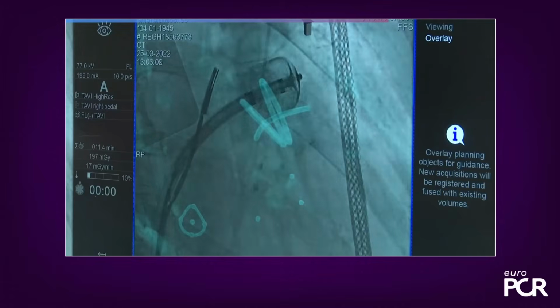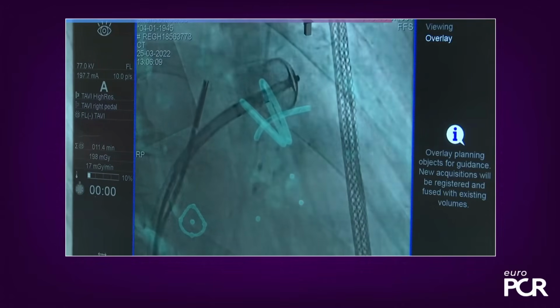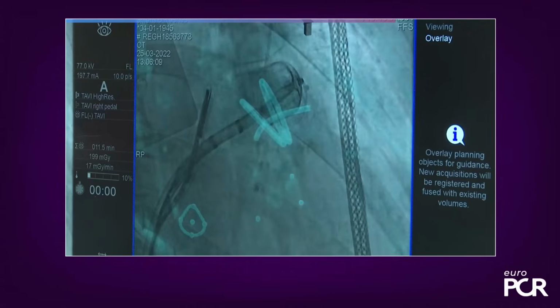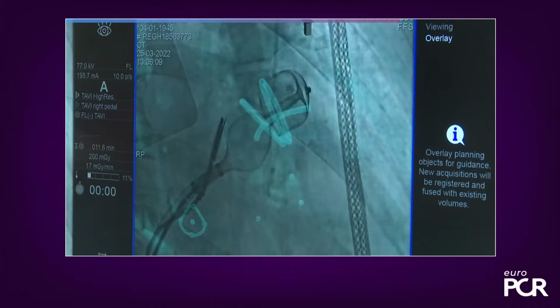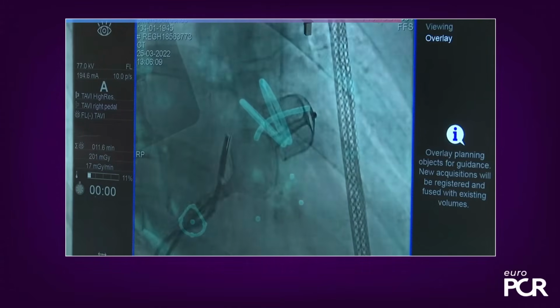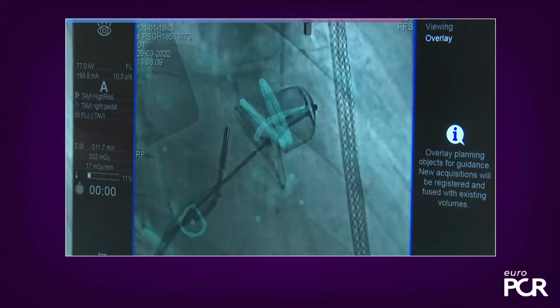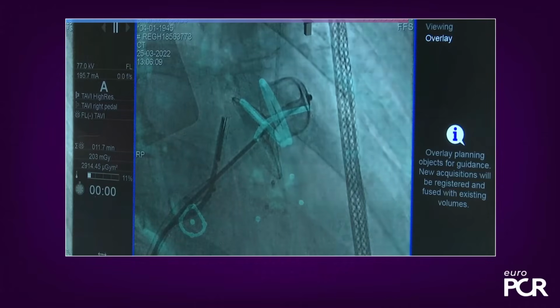Yeah, and we now come back with the sheath in order to create the disc. So that you do, Lars, so you keep the device in place and you unsheath this disc, yes. And we have at the same time a good tug here. Now we push the device, the cable, a little bit forward. And now, beautiful. And also on fusion, it's actually a beautiful demonstration, I think. So live, I will go to live image.